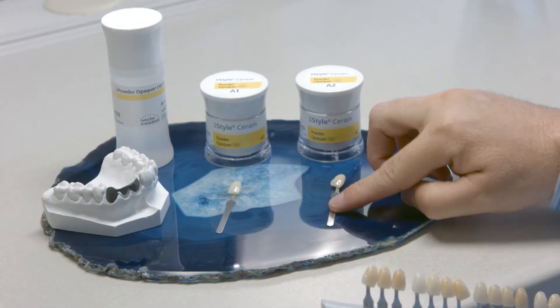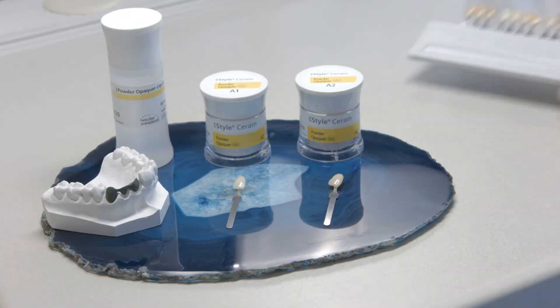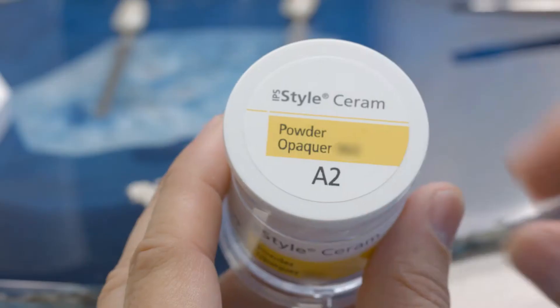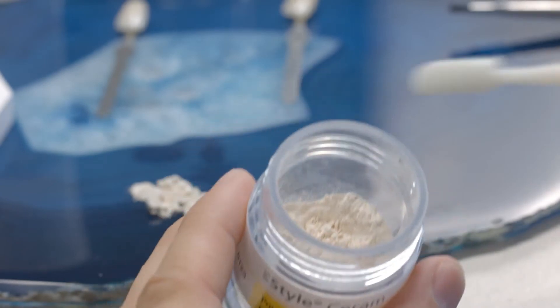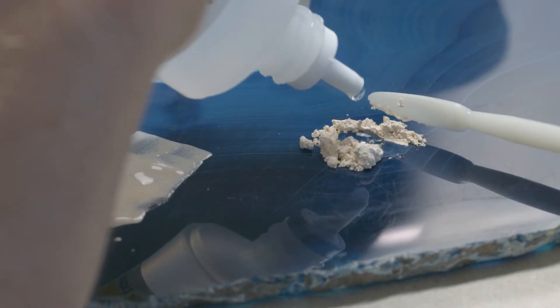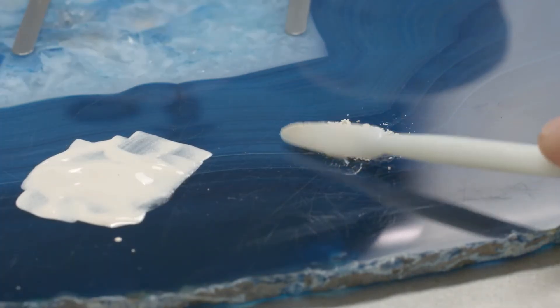Choose the IPS Style Ceram Powder Opaquer that corresponds to the desired tooth shade. Mix the amount of opaquer powder required for the first layer with the IPS Powder Opaquer liquid until you achieve the desired consistency.